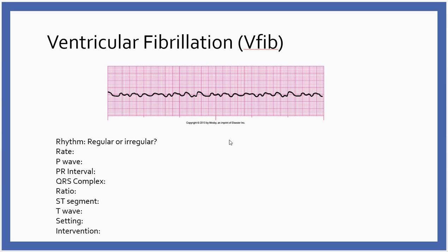So as I said, you've got to assess your patient first. And if they're pulseless and non-responsive, you're going to initiate CPR, and we're going to get our code team into the room, and we're going to defibrillate as quickly as possible, and we're going to be moving right into the ACLS algorithm.